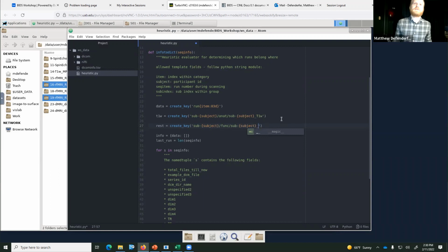So what I would say is that, for scans that had to be repeated due to quality purposes, where you're excluding the first one, there are a couple of ways to manage that. You can either convert all of them and then have a note for people that are using it in the README files.